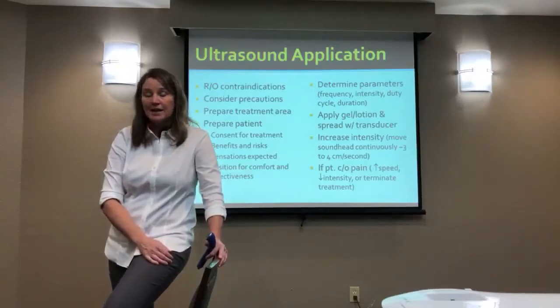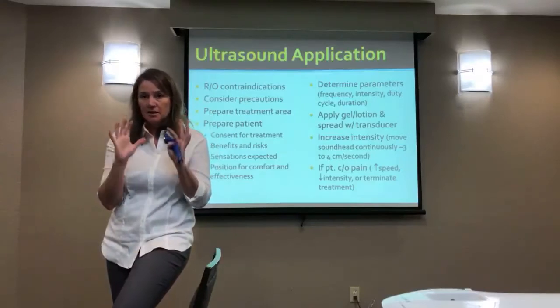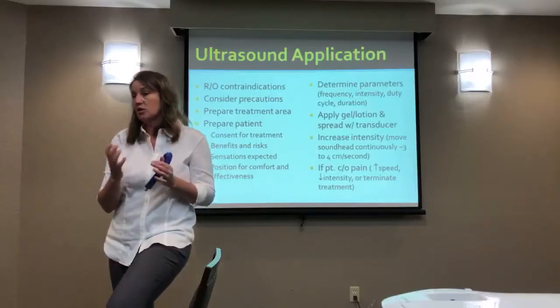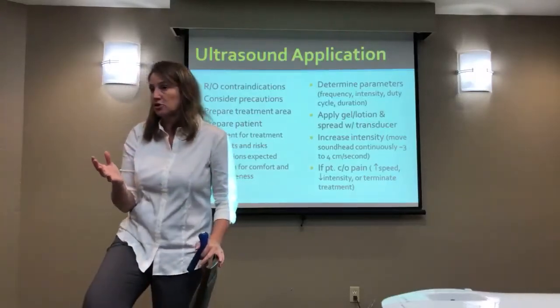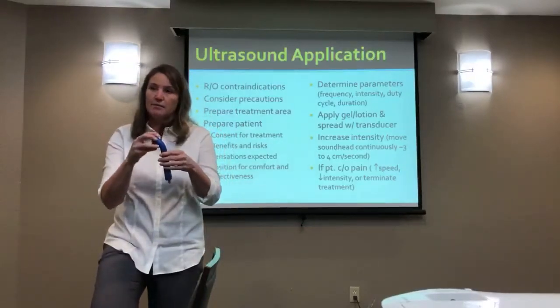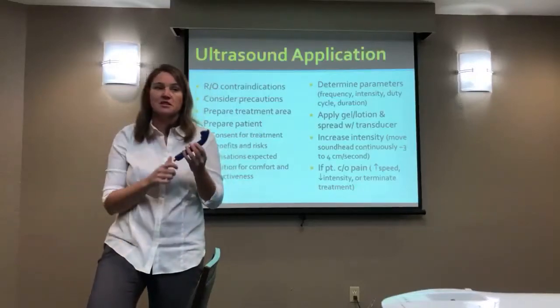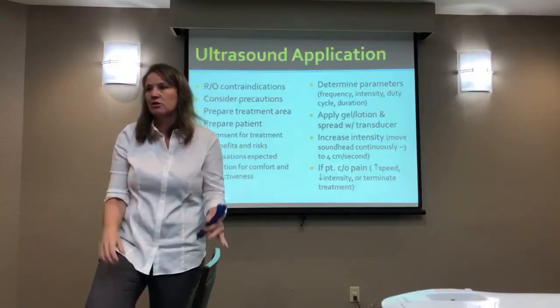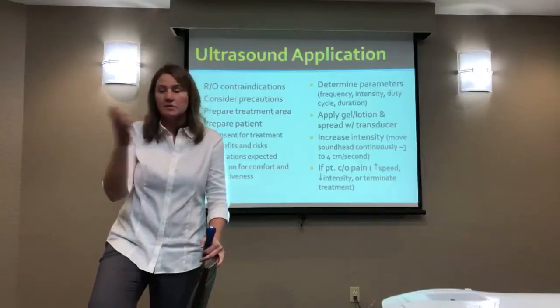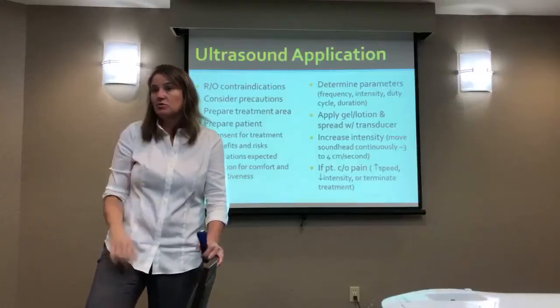And again, I still find that the way you clean it and using good hand hygiene is going to be the number one thing you can do. Specific to your device, you can always ask the manufacturer just to make sure, because they may tell you you can use certain solutions on the head, but not on the touch screen or the wire itself, because bleach could be drying and damage it over time. Or they may tell you you can use bleach, but you need to rinse it off afterwards. I would just recommend that, depending on your device. But a lot of them have cracks and crevices that you should be concerned about.